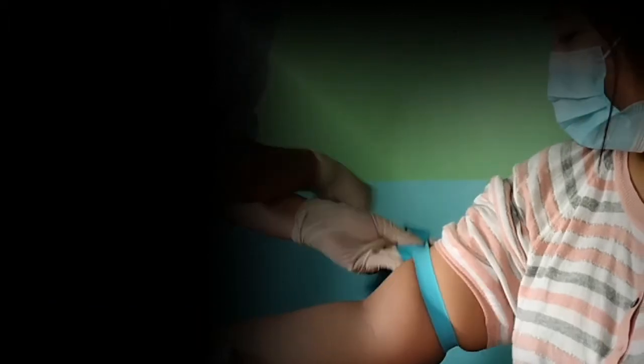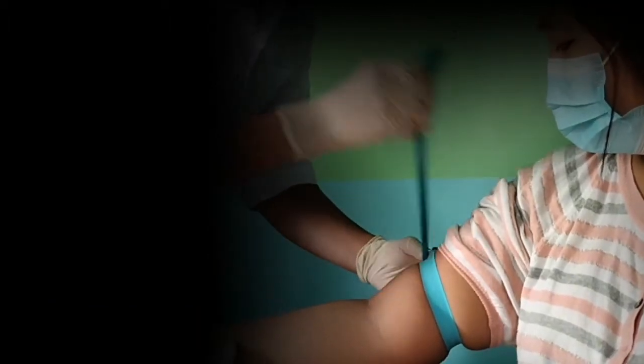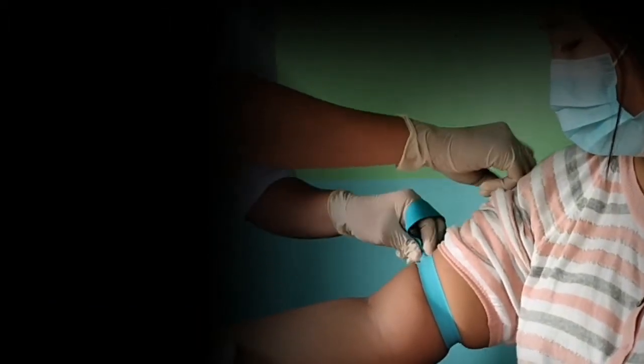Then reapply the tourniquet. Always make sure it's not too loose or too tight.